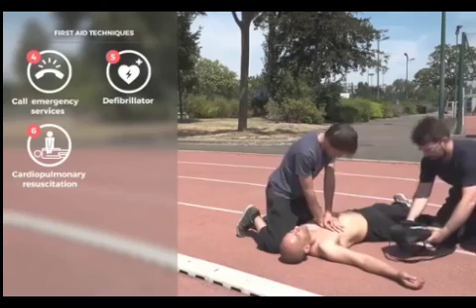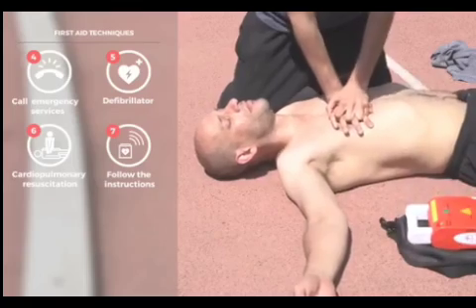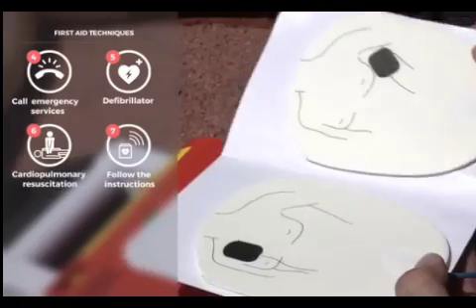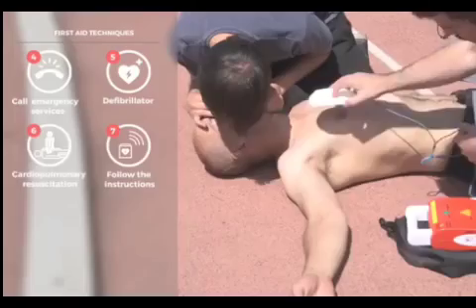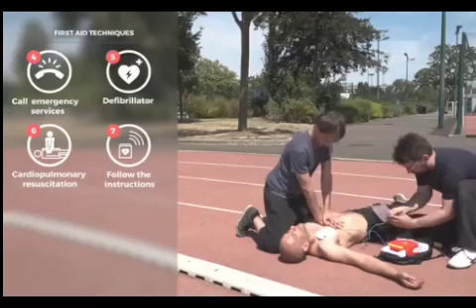Once the defibrillator has been brought to the casualty, turn it on and follow the instructions that it gives, or that come with it. Take out the electrode paddles from their packaging, remove their protective film, and place each electrode as illustrated in the diagram, included on the packaging or on the electrode itself.